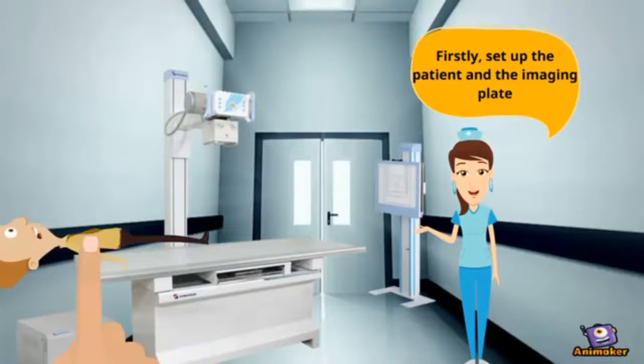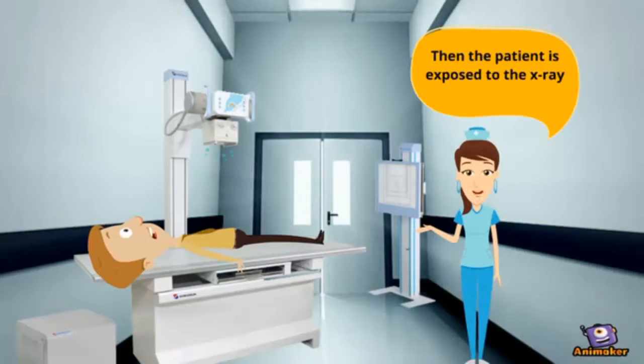Firstly, set up the patient and the imaging plate. Then, the patient is exposed to the X-ray.